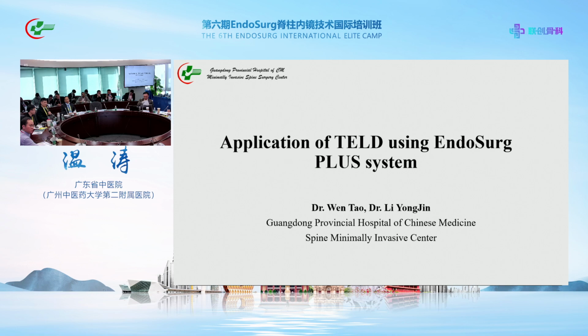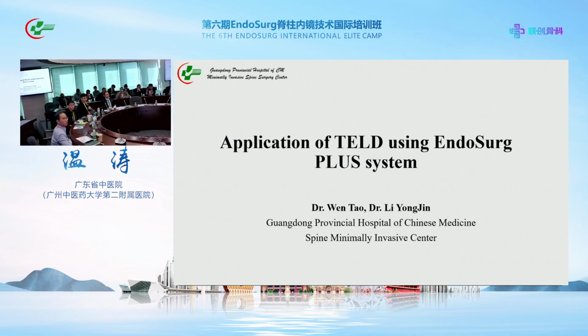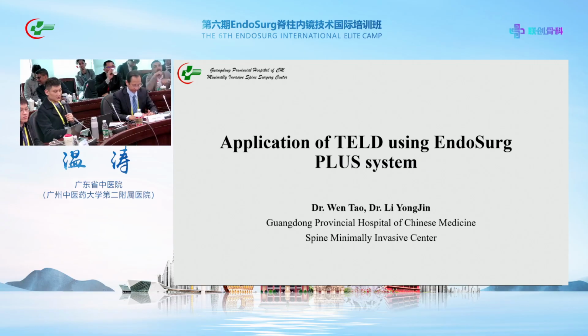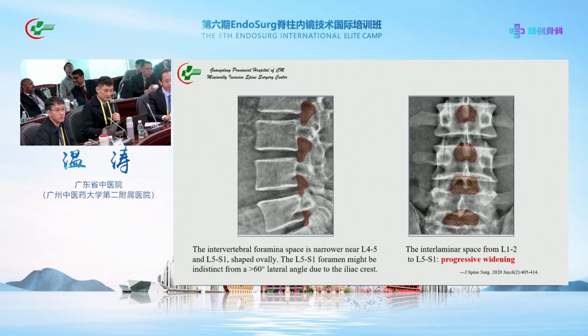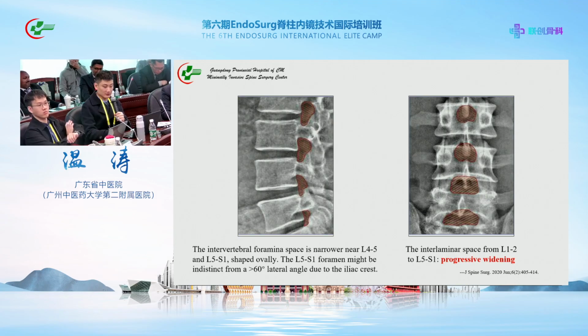Thank you, everyone. Today my topic is about TELD using the EndoSurg PLUS system. TELD is the transforaminal endoscopic lumbar discectomy. So we have a quick look at the anatomical details of the inner body.